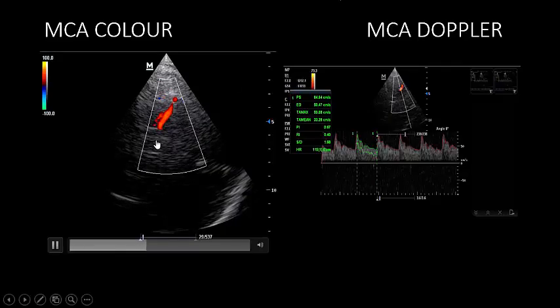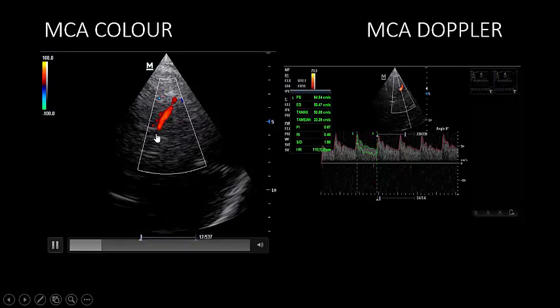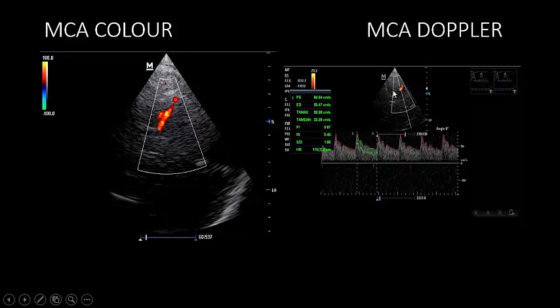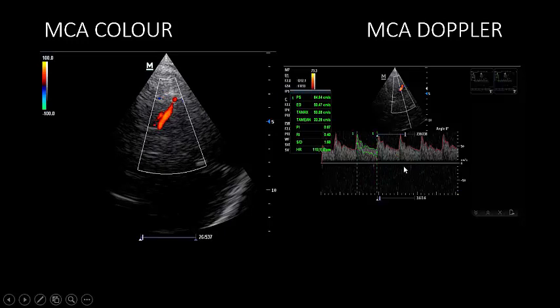Now, after placing the probe in the temporal region with 30 degrees from the horizontal and performing tilting and rotation to get the cerebral vessels, you need to know the basics of Doppler study — spectral Doppler and color flow Doppler. The basic Doppler rule is: any blood flow towards the probe gives you red color and a positive wave above the baseline in the spectral waveform.